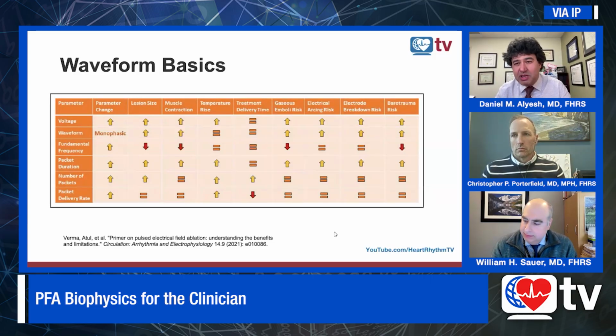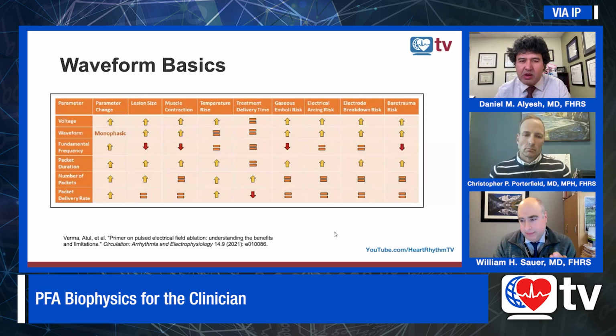I think we as an EP community have really put a lot of trust, quite frankly, in a lot of the pre-work that was done to develop these algorithms, probably more so than we ever have. That's the reason why we did this segment: we want EPs to think critically as they evaluate the newer technology, because if they have this basis for understanding what goes into a waveform, what impacts it, the limits of thermal application, and understanding monopolar versus bipolar, I think this can be foundational for evaluating what you're going to bring in and how you're going to apply it.